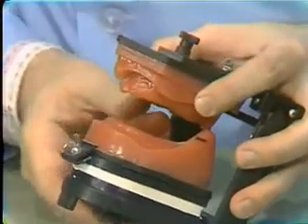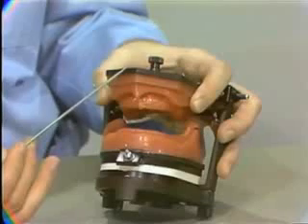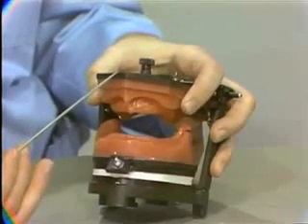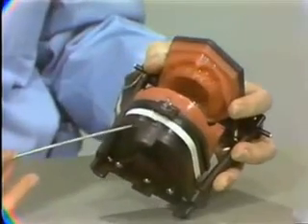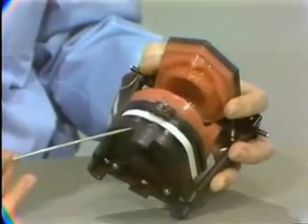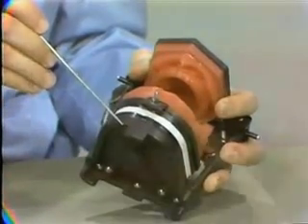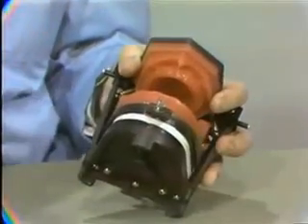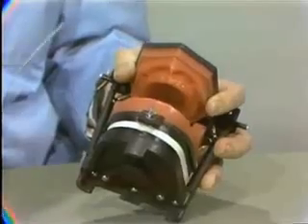Now, let me go over those measuring points so everybody has the correct place. We measure from the top of the top plate of your Visiodont. From there, we measure straight down to the lower rim of the bottom plate of the Visiodont. And you'll see that a couple more times, so we make sure everybody measures from the correct place.